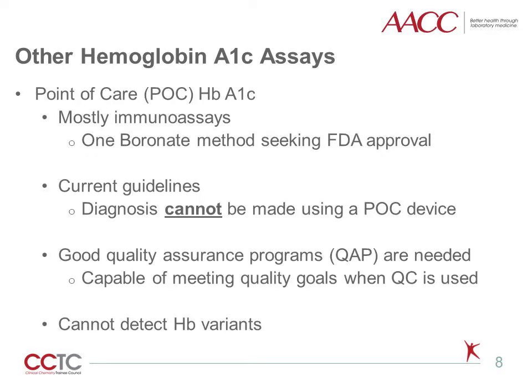Immunoassays are the predominant approach used in point-of-care devices. However, one boronate affinity method is currently seeking FDA approval. Current guidelines state that a diagnosis of diabetes cannot be made with a point-of-care hemoglobin A1c device due predominantly to the lack of good QC material.